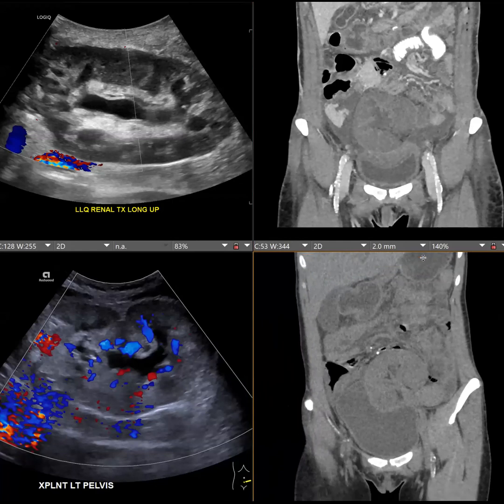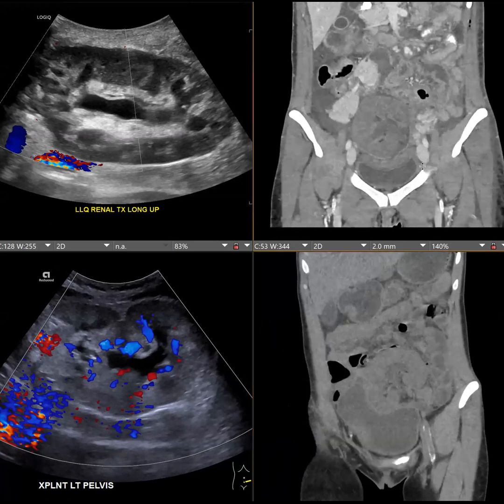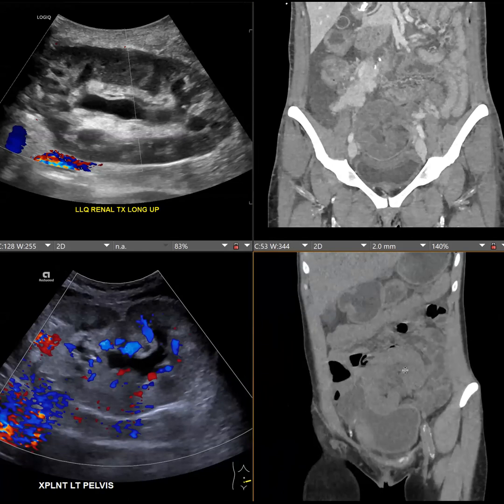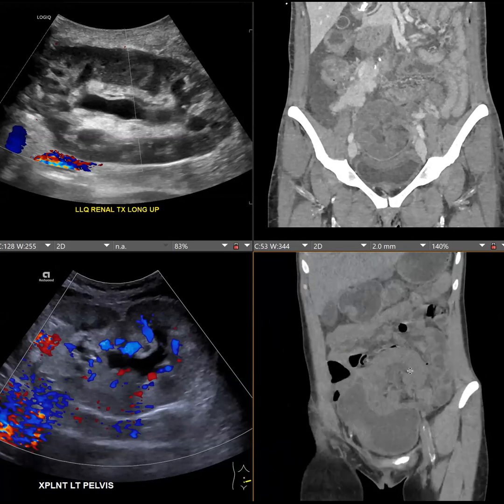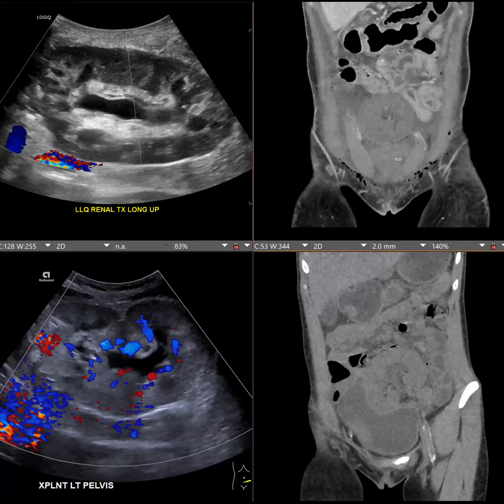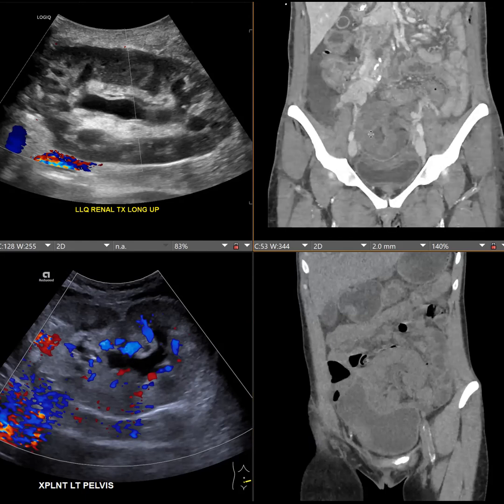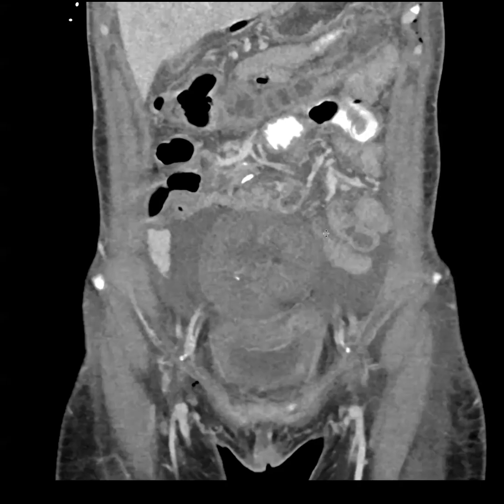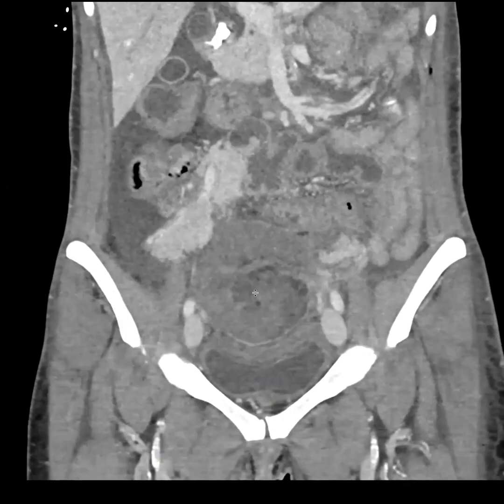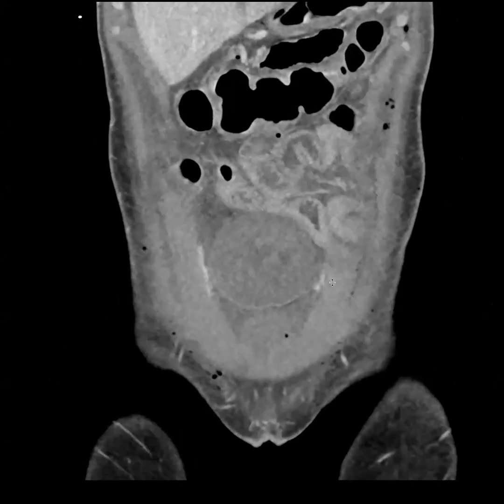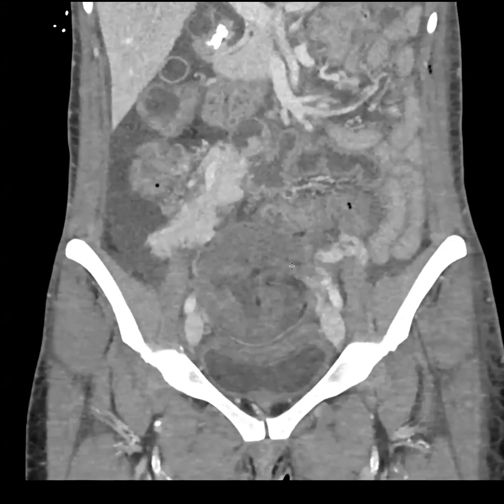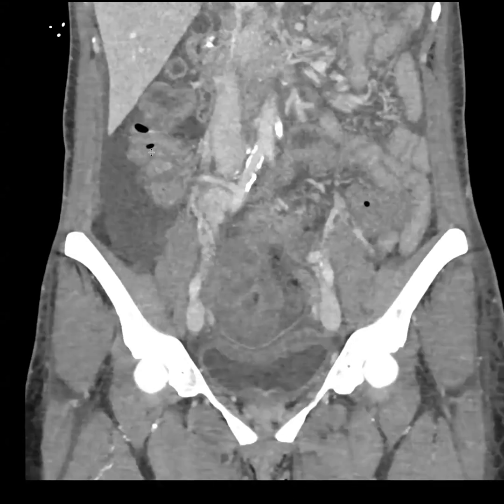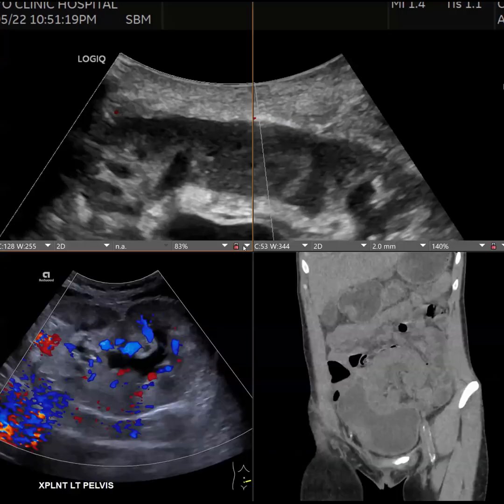On the prior imaging, the kidney is in the left lower quadrant as expected. On the current scan, the kidney itself has rotated more medially and centrally. There's free fluid. On the venous phase, the parenchyma should be enhancing, but there's no enhancement of the transplant kidney at all. You can see the normal vessels enhancing, but the intrahilar vessels are not enhancing. The renal ultrasound confirmed the finding we suspected on CT.